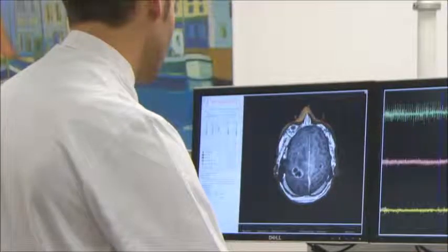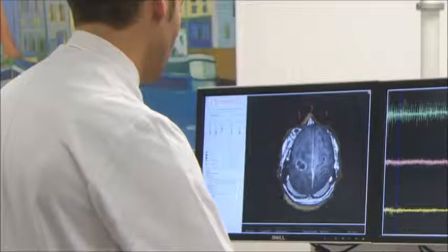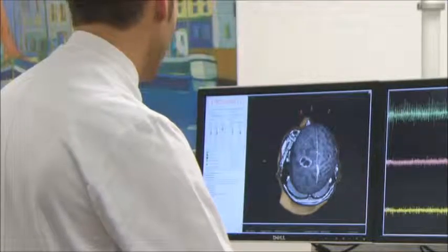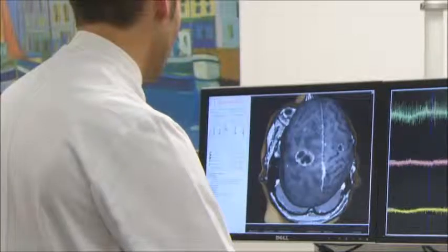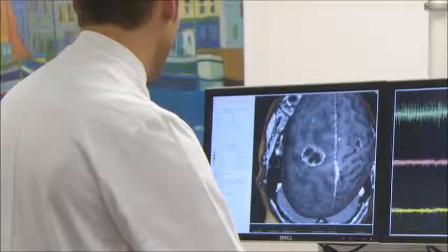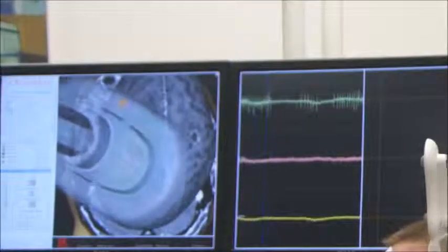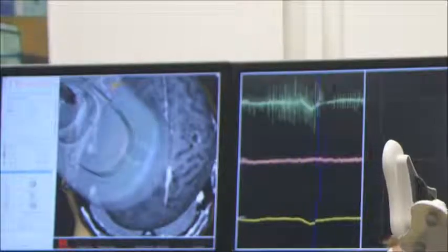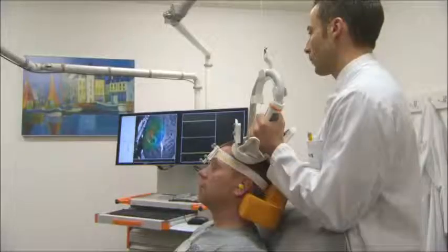Triggering the TMS coil will induce a stimulating electric field, E field, in the underlying cortex. As the TMS coil is moved, the NBS system displays, in real time, the amplitude and direction of the E field, calculated for the individual patient.